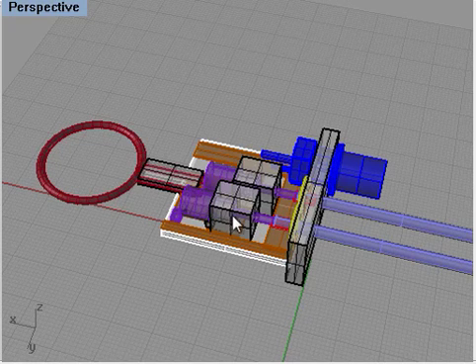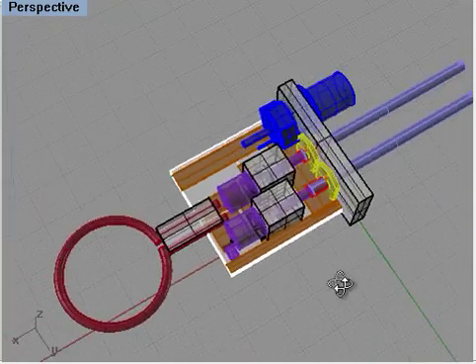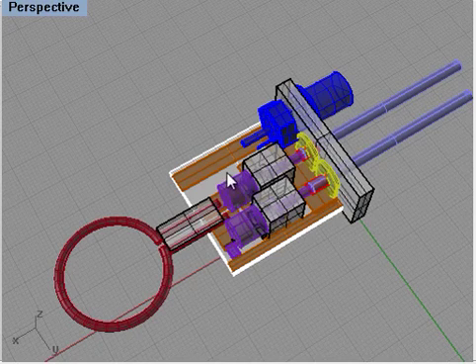The adjustment in capacitance is done by turning the shaft here. When you turn this shaft, there's going to be a force on the capacitor, so you need to fix the capacitor to the circuit board tightly. So basically what I wanted to show you is just the matching network. So you have the two capacitors here.